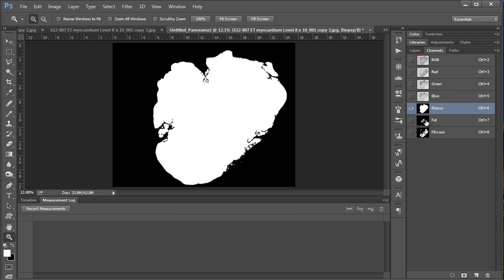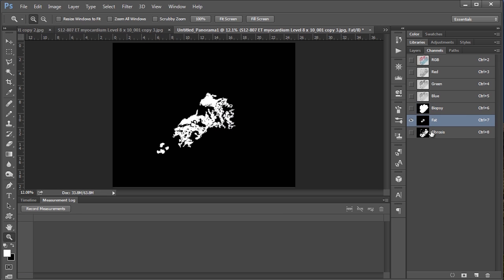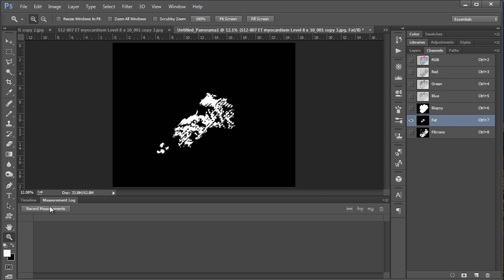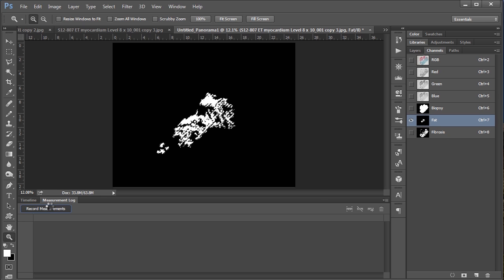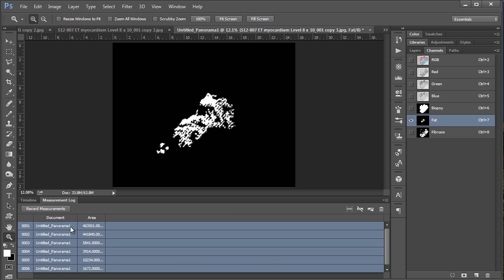And then we simply just do the exact same things for the other two channels. We click the channel, hold control while clicking the icon, and again saying record measurements. And so you see again we have a list of measurements. And once again it is the first measurement here that we're most interested in because that is the sum total.